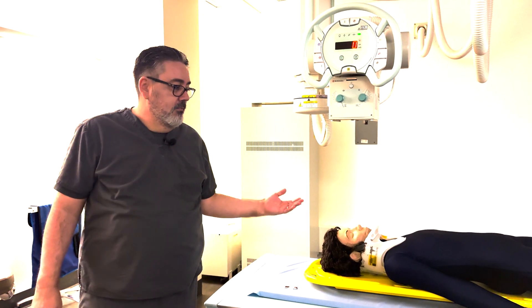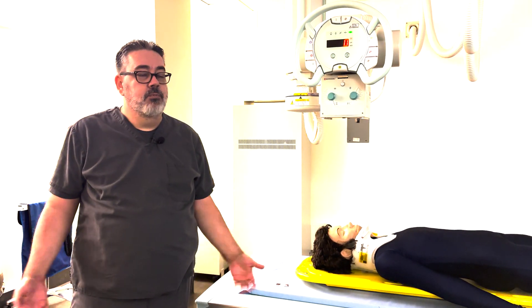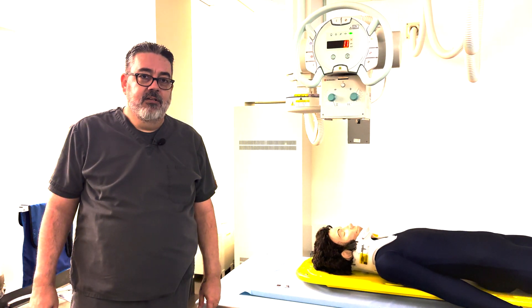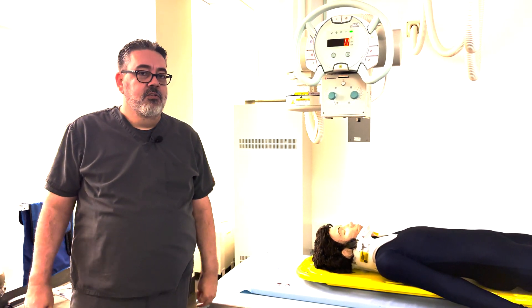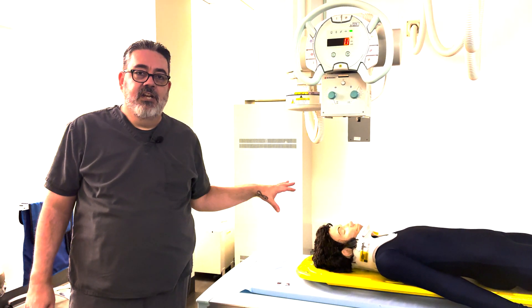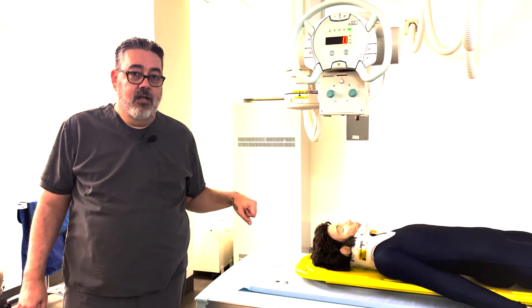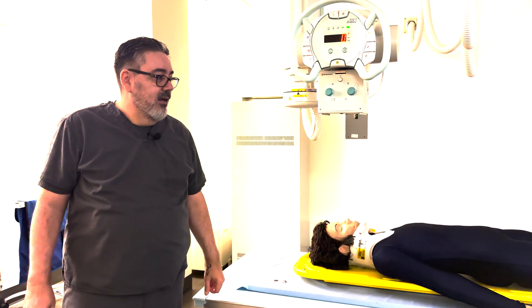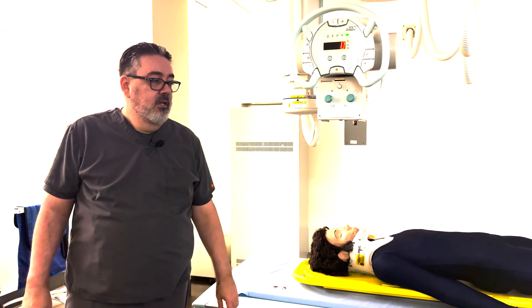We have our mannequin here in a C-collar. The important thing with any trauma, if their collar has not been cleared, is that you cannot move the patient. So we're going to leave the patient as is on the backboard and in the collar, and we're going to get our angles around the patient's position.